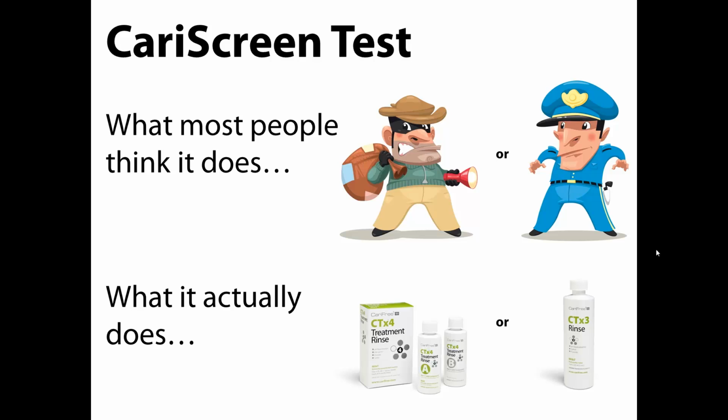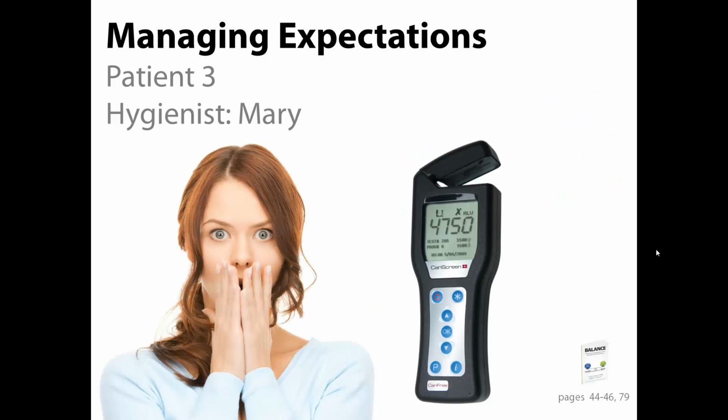I will be completely honest with you, the test itself is actually very easy. The hardest part of the test is just managing your patient's reaction to the reading. One of the scenarios we see play out all the time is a seemingly healthy patient, or even one of you, a dental professional, screen high. Sometimes the patient feels embarrassed, or shocked, or defensive because they think the meter is tattling on them and telling you they haven't been brushing or flossing like they should be, when really this is normal.